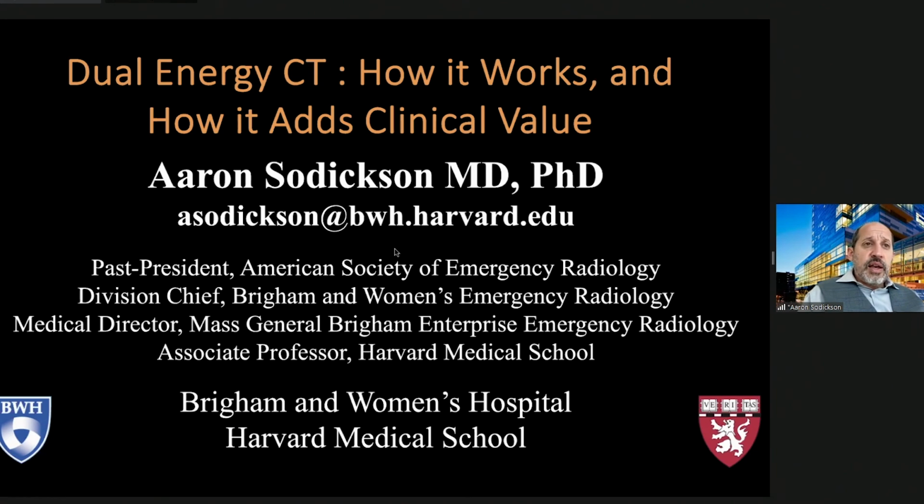The other thing to realize that I've tried to train our radiologists is that they don't actually need to review all of the dual energy images. Those are there for problem solving, for troubleshooting. I'm happy to serve as an expert witness if anybody gets sued because they didn't see something on one of the extra dual energy images that were there. But think about it. We send thin images all the time to PACS for problem solving or to make MPRs if we need to tease something apart. None of us routinely look at every thin 0.6 millimeter image throughout the entire body. So we have some precedent for additional series that are there for problem solving.